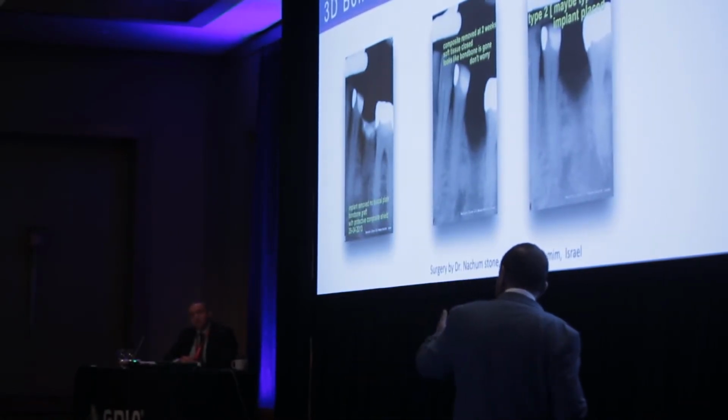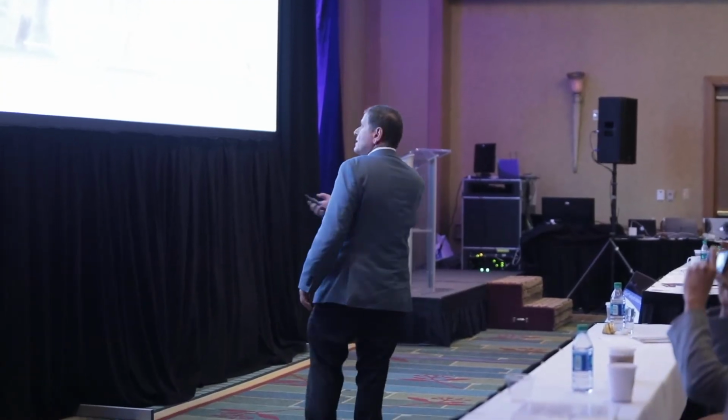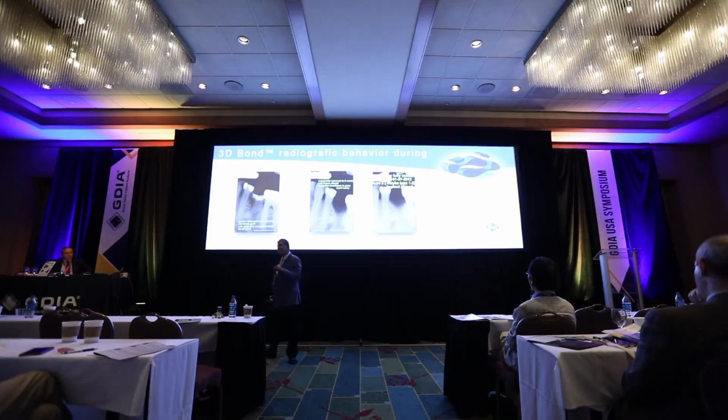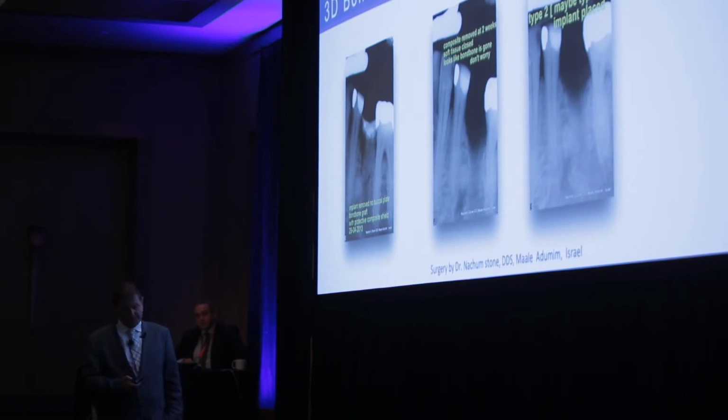Now we need to remember, because of the replacement of this graft into the patient-owned bone, we're going to see a completely different radiographic behavior. First day, it will appear radiopaque. 2-3 weeks later on, everything will disappear. Most of you are not familiar with this phenomenon and will be sure that you lost the graft, but actually this is the osteoid before calcification. This shows you that something happened here. You continue to wait up to 3 months, and you see beautiful, dense bone in the area.